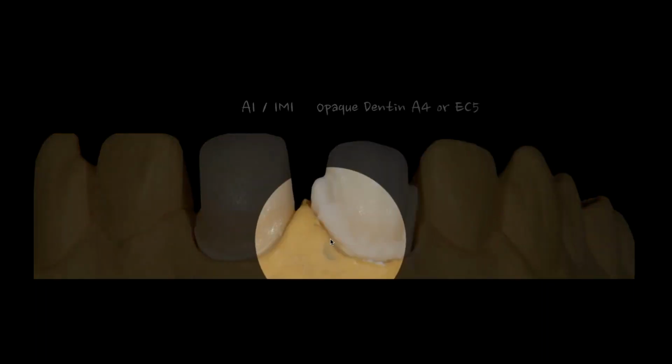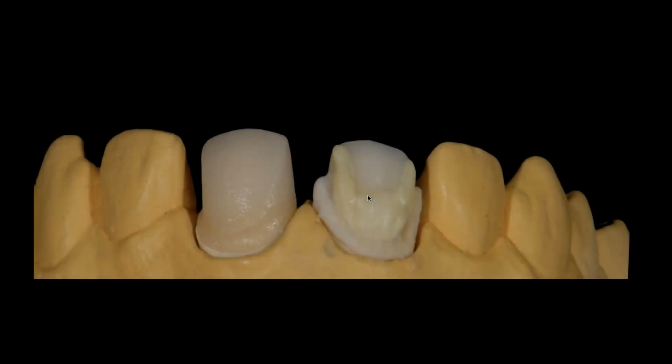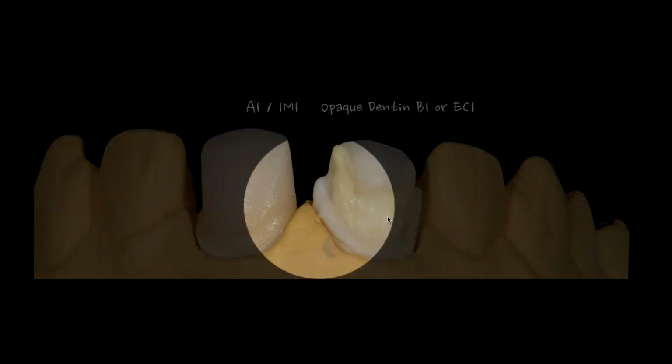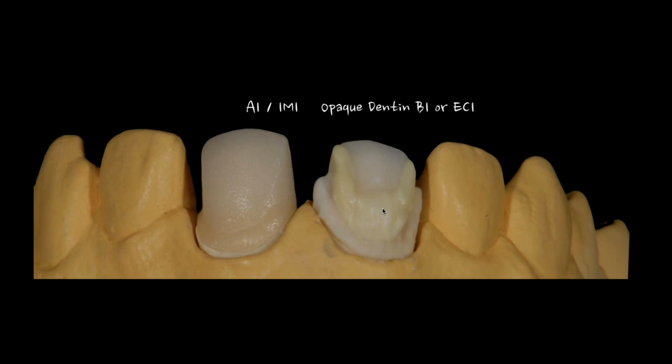Second area that I'm going to want to work in is my value, right? So I always want chroma in the cervical. I want value here. Again, A1, 1M1, but I'm going to use B1 in this particular case. I'm using B1 because that's what I have in the kit. If I was using a different kit, I might use EC1, depending on which kit you're using. But what am I really trying to do? Get something whiter and brighter. And the reason I want the whiter and brighter is because I want the most reflective index here. And I want to come up and down my line angles and get that whiter, brighter look of light reflection inside the tooth. And again, these are opacified materials.